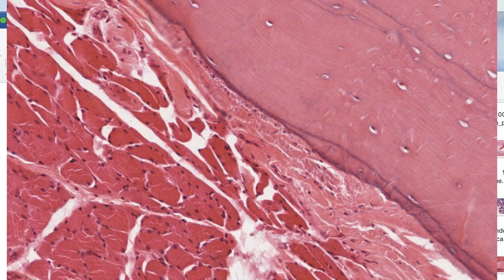When osteoblasts actively deposit bone, they're numerous, plump, and easily seen, as I'll show you in some of the later sections. Here, where bone growth has greatly slowed or stopped, the quiescent osteoblasts have reverted to a very flattened condition and are almost absent or certainly very hard to see.